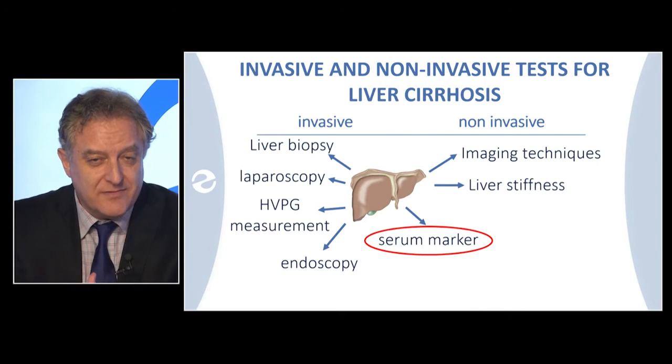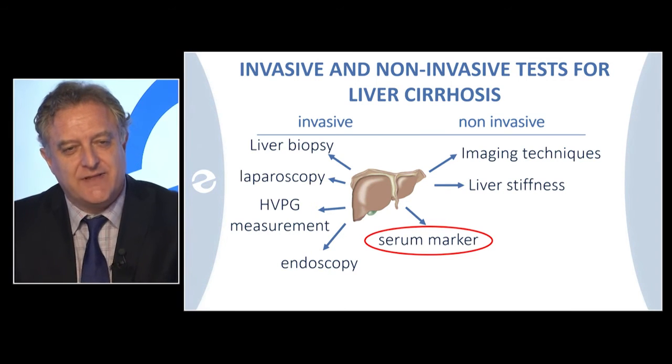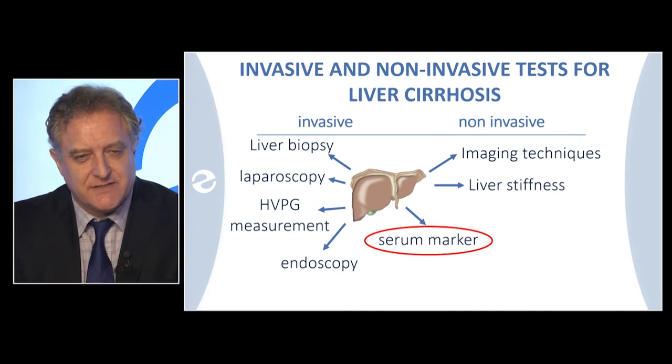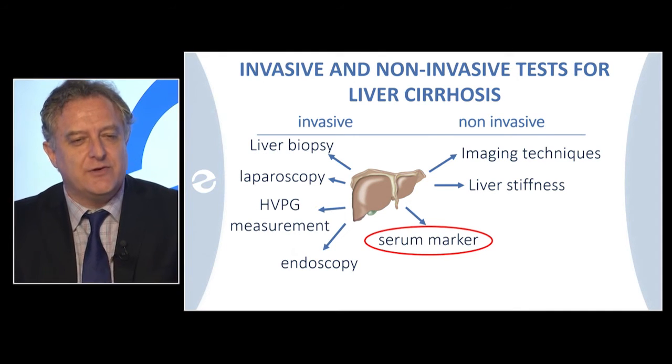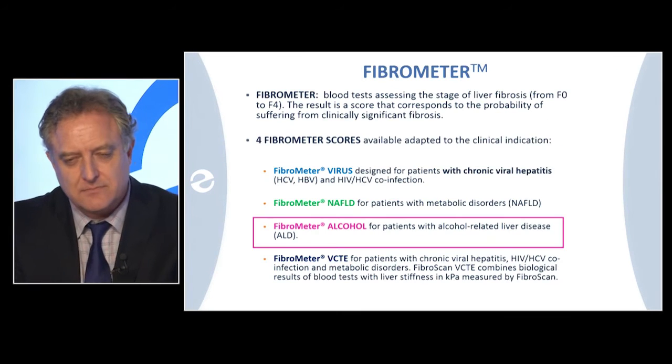Thank you so much, Sebastian. Sebastian mentioned not everything relies on FibroScan. What about if your clinic doesn't have the policy, they cannot afford a FibroScan, or you prefer serum markers? As I mentioned, serum markers in the blood, although they are not optimal, can also be very good at assessing liver fibrosis non-invasively, also in alcoholic patients.